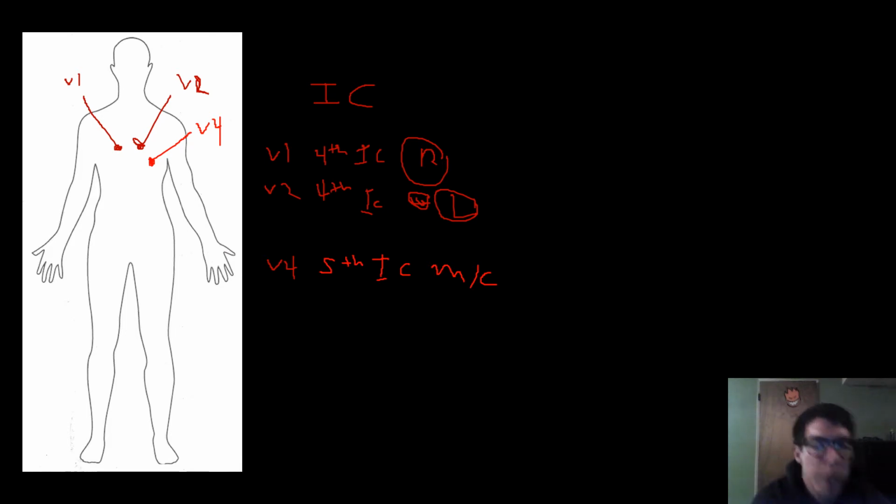So then you'd go back to V3, and that would go between V2 and V4. So right there.